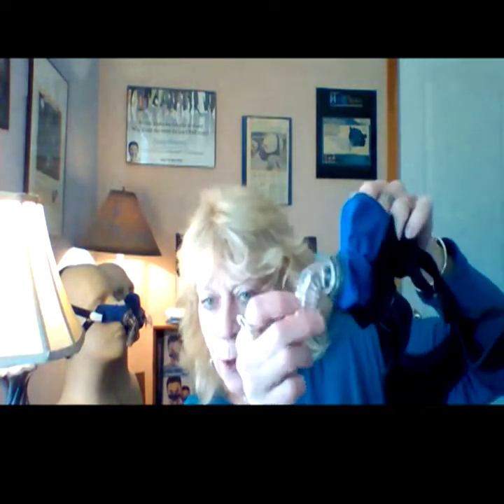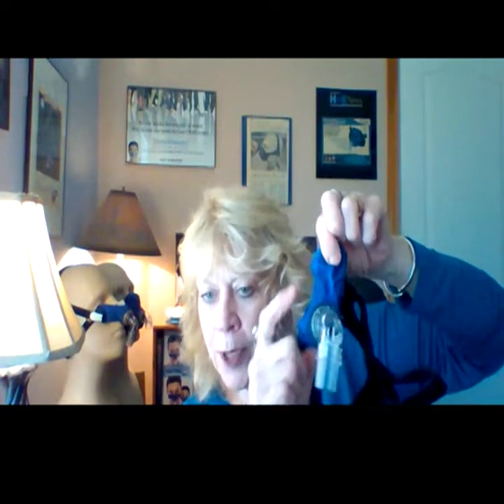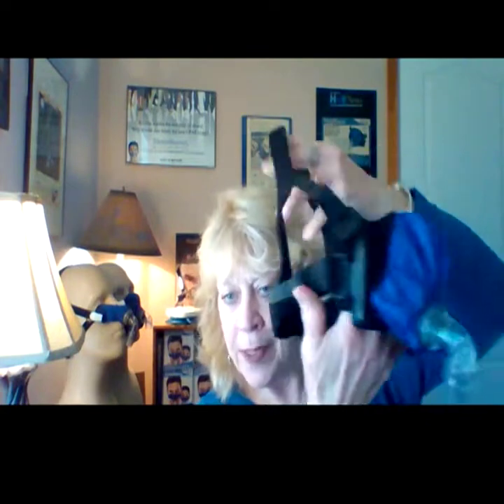Hi, everyone. I'm here today to help you with the ANU mask. The ANU mask is a full face mask, and this one has dual chambers — one for the nose and one for the mouth. When you're diagnosed as a mouth breather, this is what they're going to ask you to wear: a full face mask.